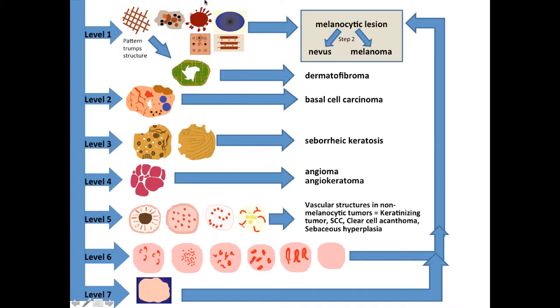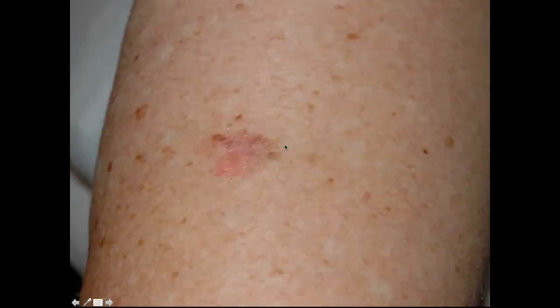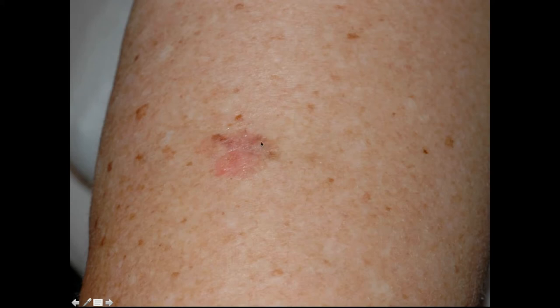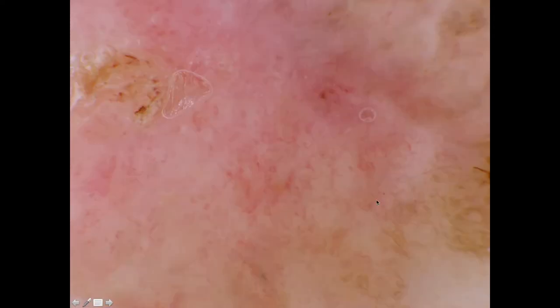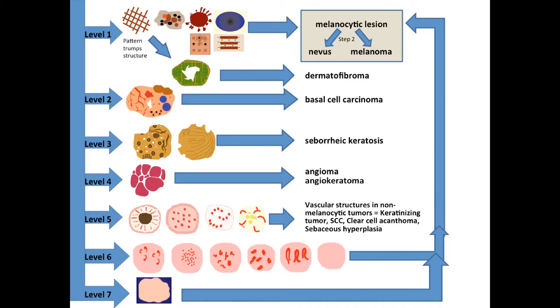First question: is this lesion melanocytic or non-melanocytic? Do we see network? Yes, we see network at the periphery. When we see network only at the periphery and not within the lesion, we need to check if there's sun-damaged skin with freckling. We can't say with 100% certainty that this reticulation belongs to the lesion or the background skin. Let's presume if it is part of the lesion, it would be melanocytic, and we move on with that assumption.